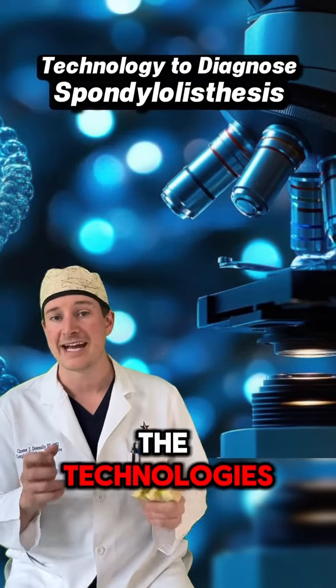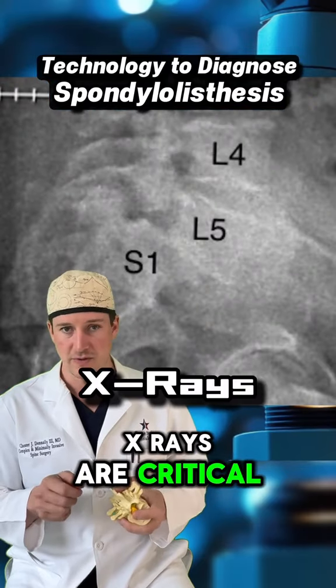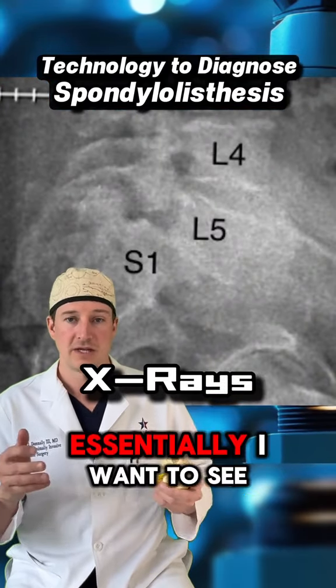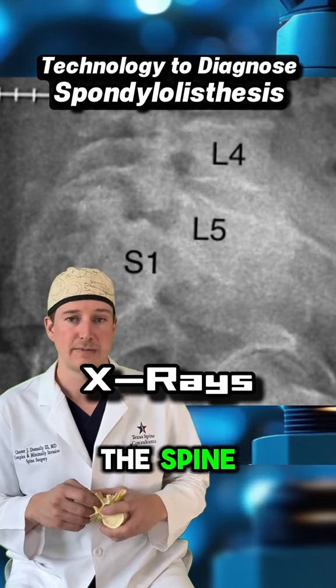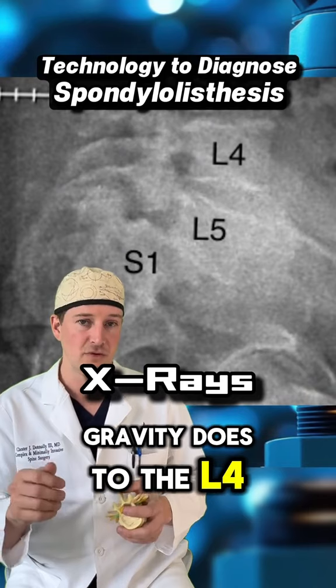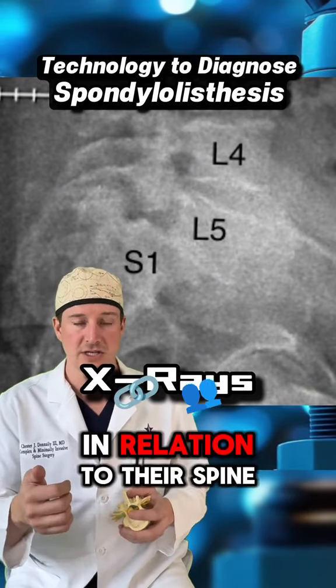So what are some of the technologies I use to diagnose it? Well, x-rays are critical, and these are x-rays where I want the patient standing up. Essentially, I want to see what gravity does to the spine. I don't want to see them when they're laying down. I want to see what gravity does to the L4, the L5, the S1. I want to see where their hips are in relation to their spine.